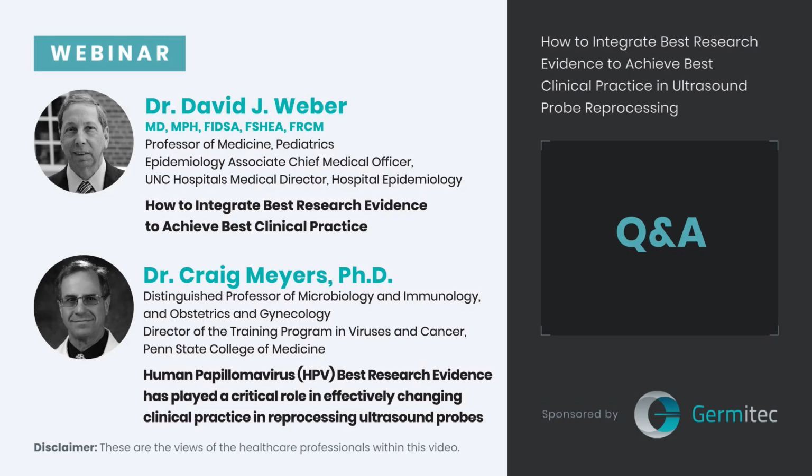The first part of the question is, what we do is we have a discussion with the manufacturer. We try to figure out what their needs are, what they want to be able to show, and then we form a protocol with their desired results, but also including controls so that we make sure the validity of the results are correct. And then once we have the protocol approved, we go ahead with doing the study. Once we have all that done, it could take 2 to 4 weeks for us to finish the study.